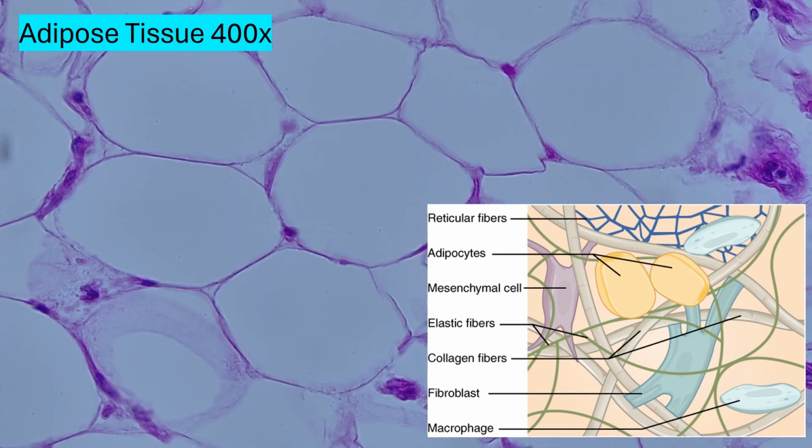Here we're looking at adipose tissue, more specifically white adipose, which is most abundant in adults. There is a single large lipid droplet here in the middle. In brown fat, or as known as baby fat, there will be multiple droplets inside of this cell. Simply put, this slide is what we commonly think about when we think about fat. Here is our adipocyte. Draw around it.